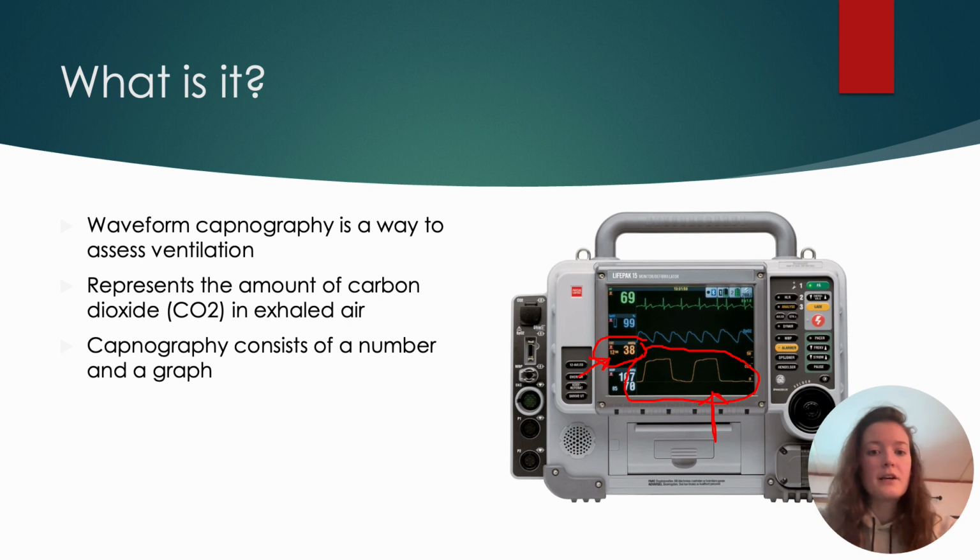And it could tell you respiratory rate, it's small, the end tidal CO2 in millimeters of mercury, and then obviously this graph.